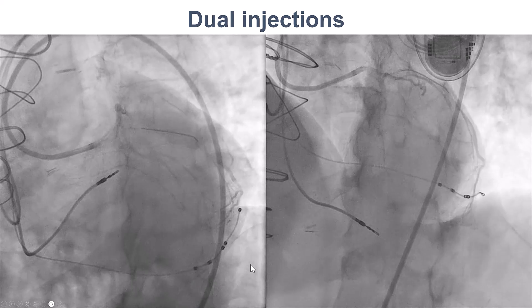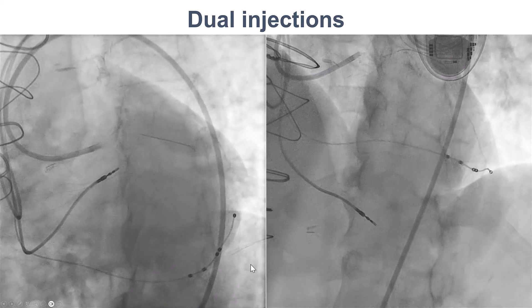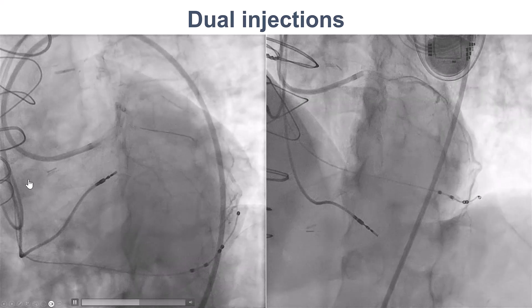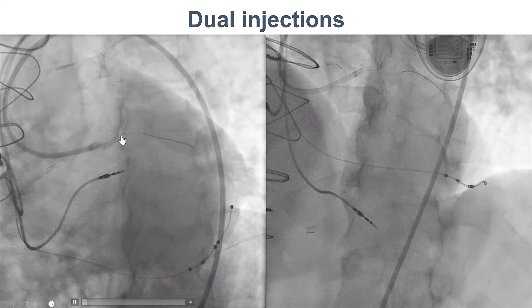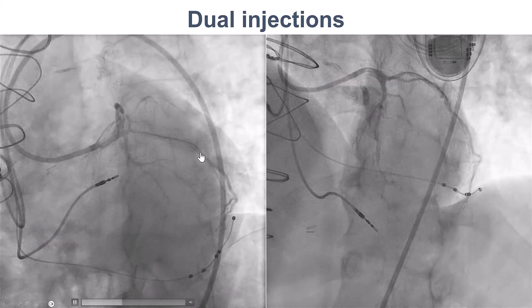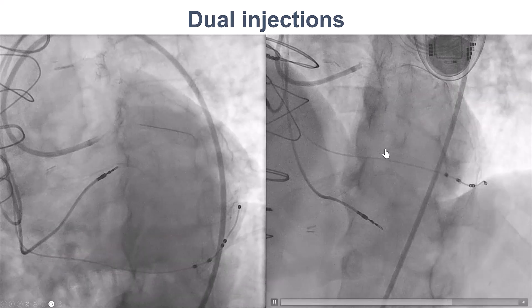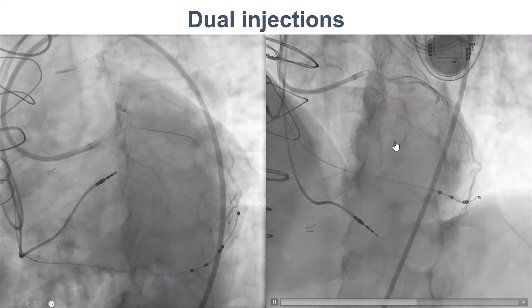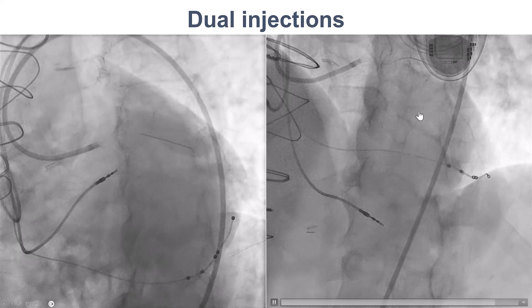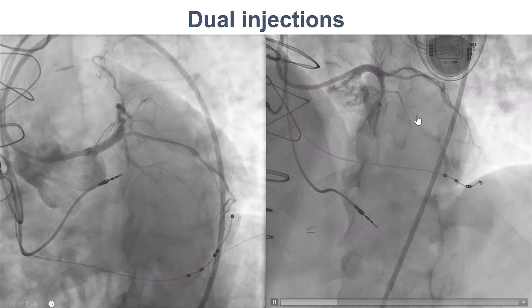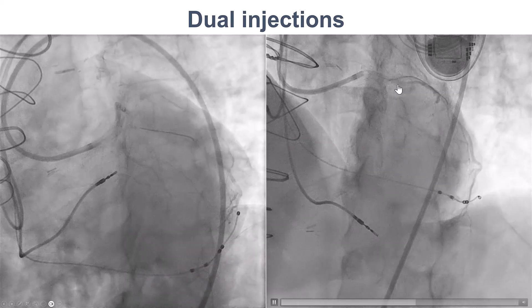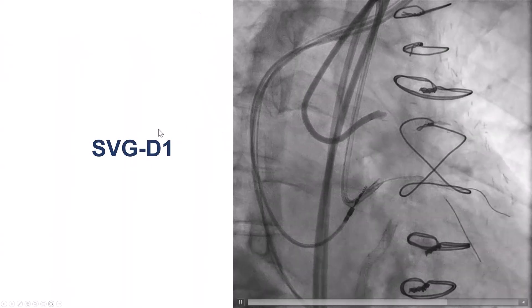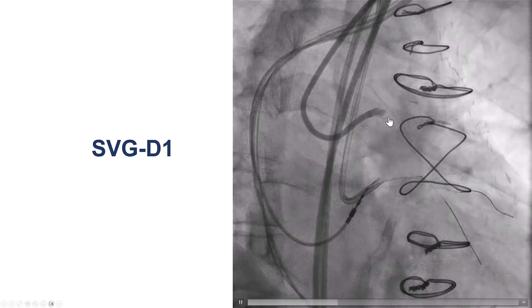He was sent in an attempt to recanalize the native first diagonal. On the angiogram, there is a patent circumflex and patent ramus. The LAD has competitive flow from the LIMA. However, it's very hard to know where the diagonal branch is coming from. We have this very small first diagonal, but we did not have access to previous angiograms. This was the stump from the vein graft to the first diagonal branch.